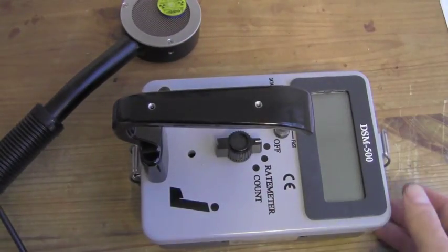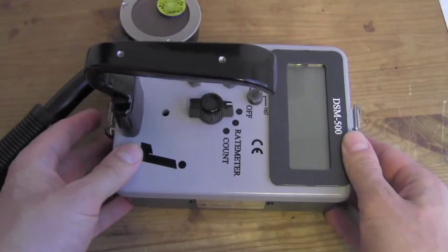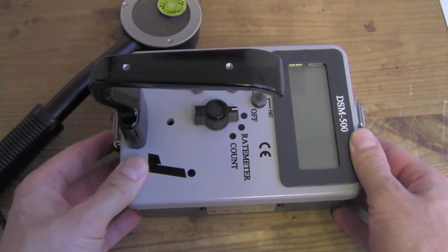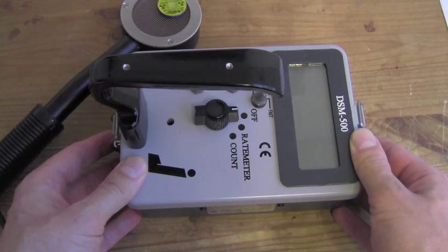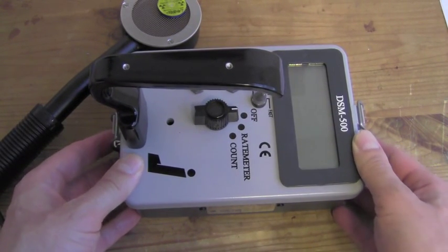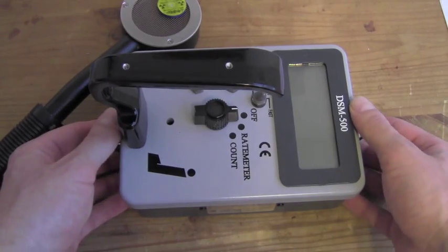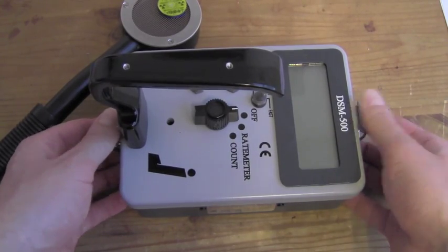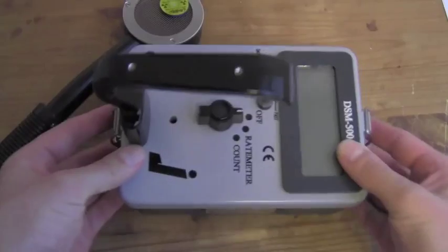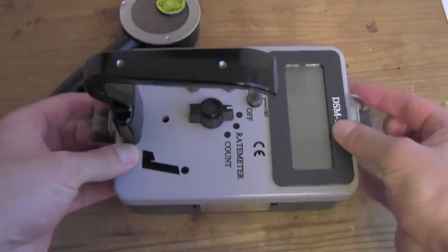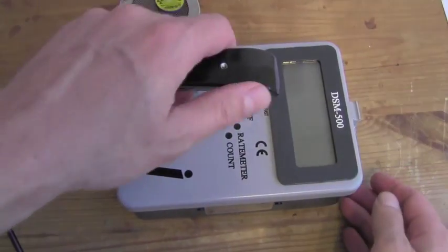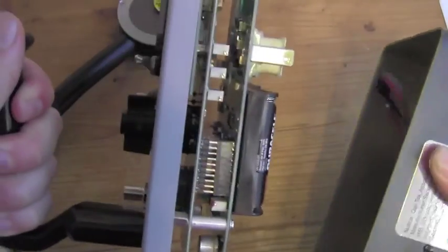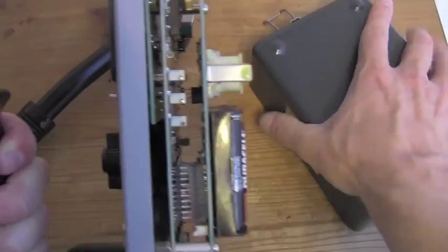We take the housing off to recalibrate the instrument, to change the units to SI units, or to change the batteries or make other adjustments. It is very easily done. There are two latches on each side. Open that, take the housing off.